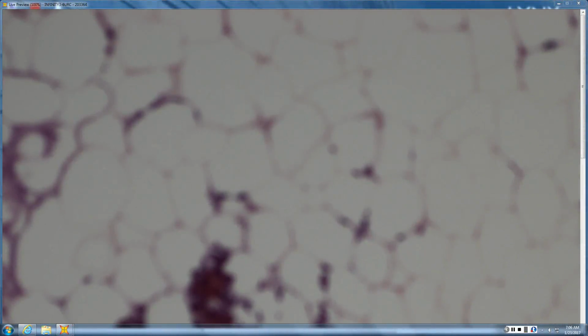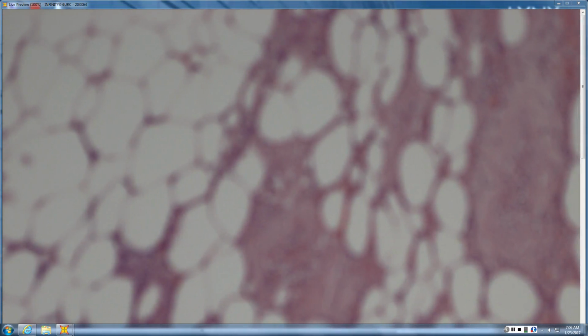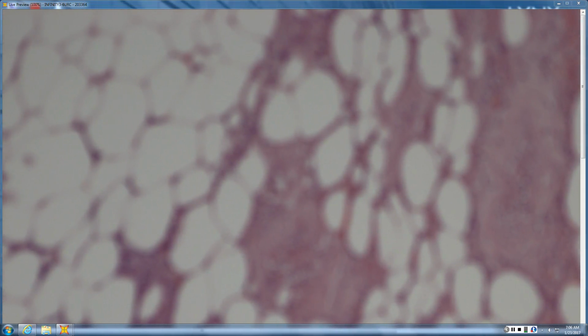So when there's a question of calciphylaxis, you really want to find small vessels that are involved and look for those. Like here, you've got calcium deposition. You can get, I think it's called Mönckeberg's medial calcific sclerosis, when with time you get calcification in the walls of arteries, akin to coronary artery disease. So you really want to find it in some of the smaller vessels. But this is basically an example of calciphylaxis.